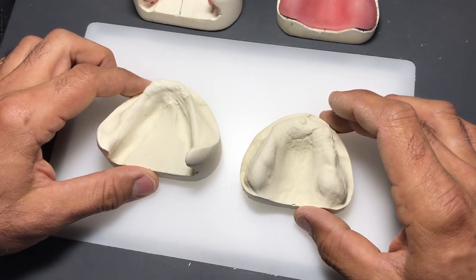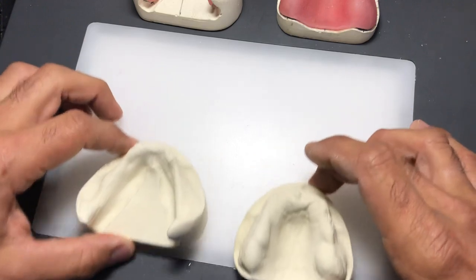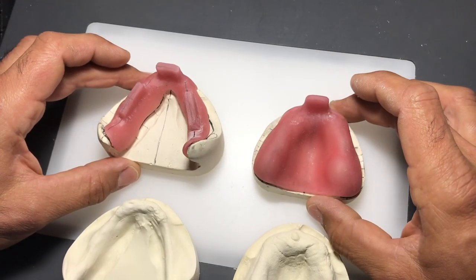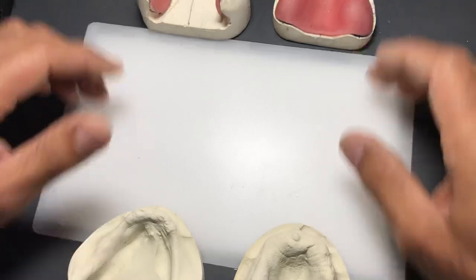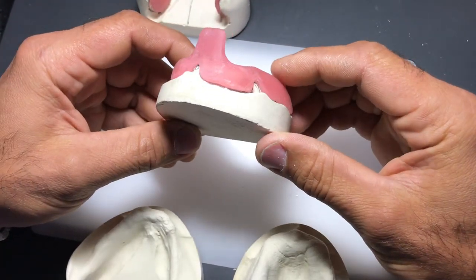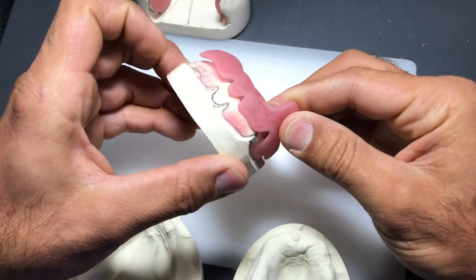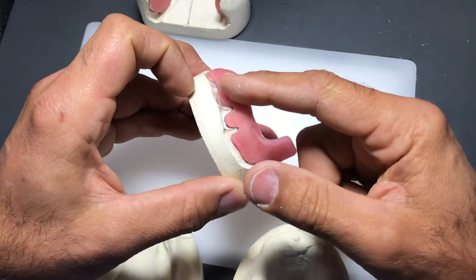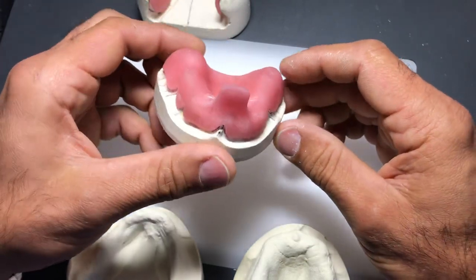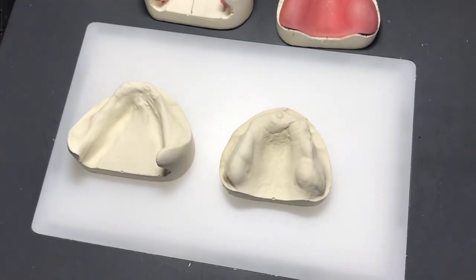Unlike the first impression which used alginate - a great material for many things but not for full upper and lower dentures - we need to go from the preliminary model to the custom tray. To do that, we need to identify some anatomical landmarks on the models to fabricate these custom trays with the right shape and length. You can see I've indicated an outline where I think the denture will extend.